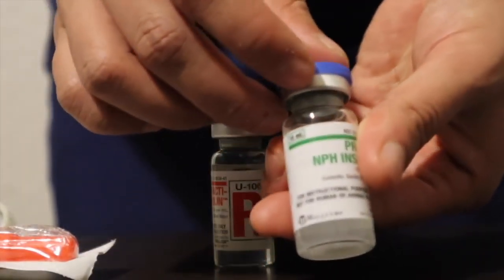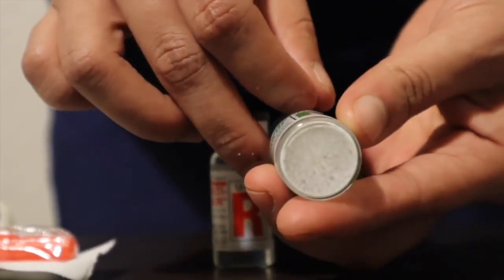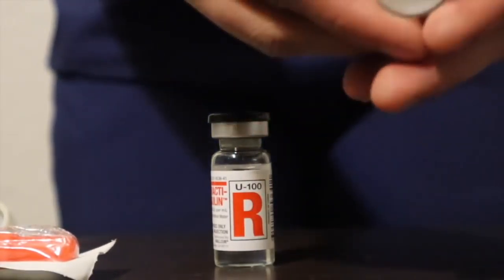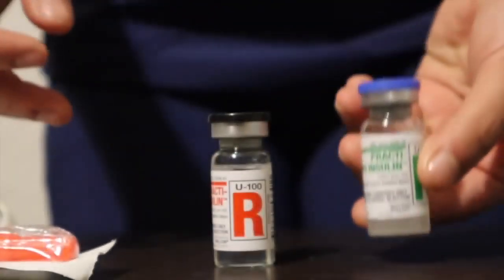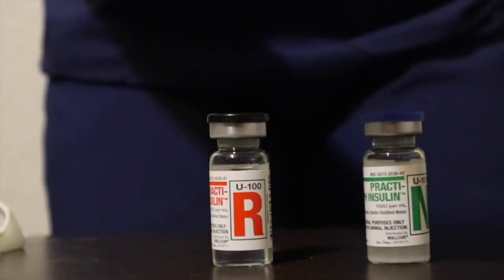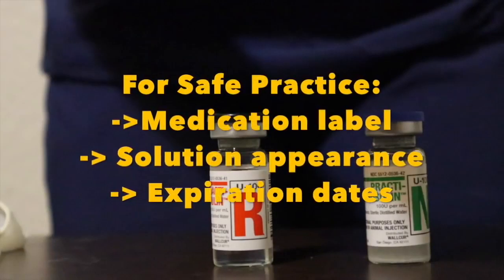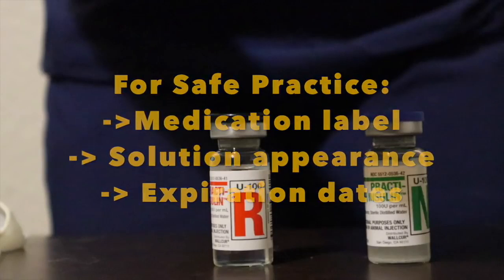The vial on the right with a big green N is NPH insulin. You can identify this because it has particles on the bottom, and as I roll the vial in my hand the solution becomes cloudy. I don't want to shake the vial because I can potentially introduce air bubbles. For safe practice, it's important to compare the medication name label to the solution appearance and check your expiration date.